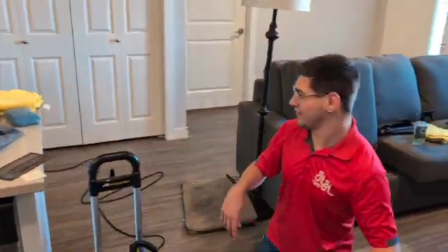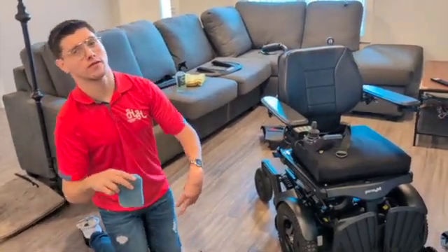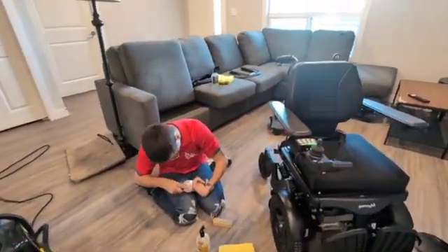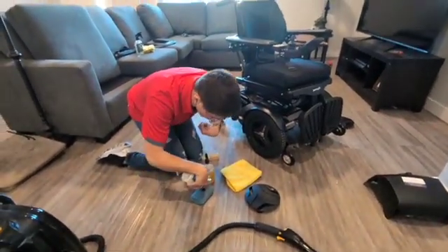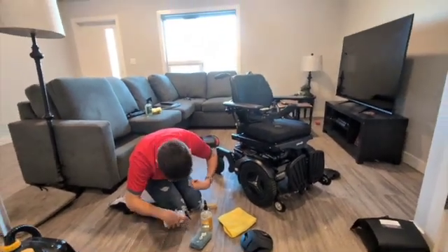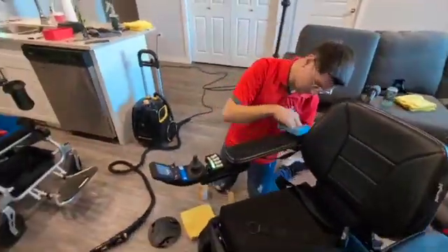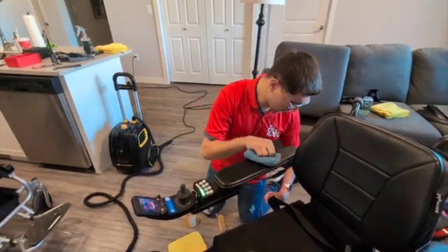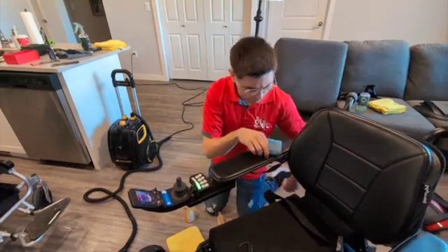Now to condition the leather. You can use a towel, but I prefer to use the applicator. It's a bit easier for me. LCS2 leather conditioning cream. Put too much on. Wiping it with the dry side. There we go. Now time for this seat.